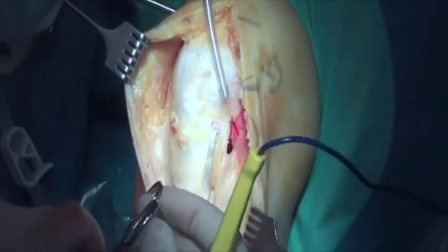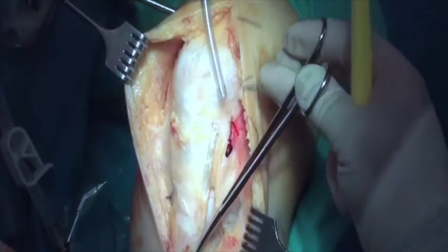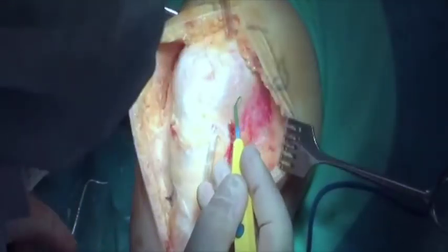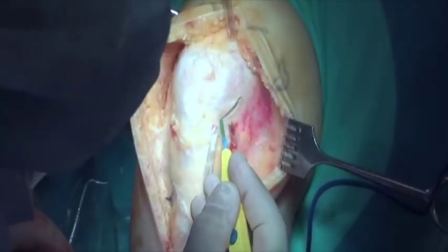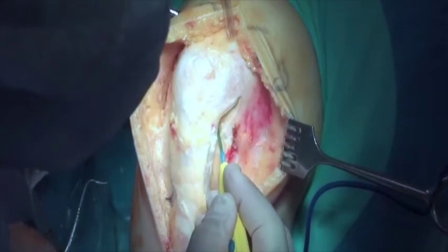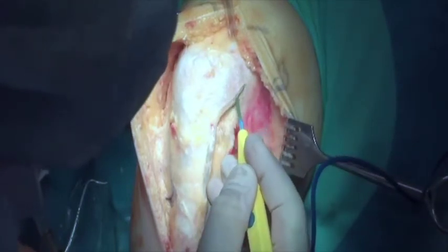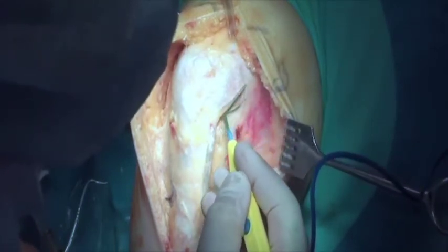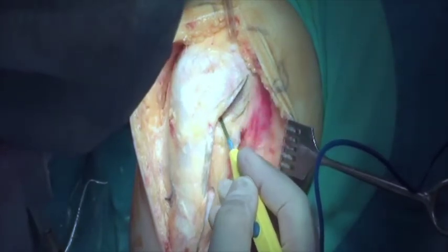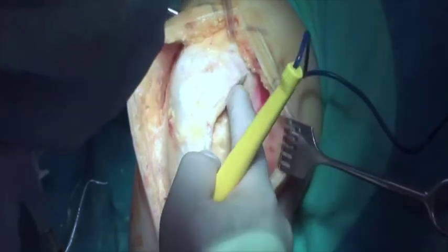A fasciotomy is then performed, releasing the proximal portion of the anterior tibial fascia. The lateral retinaculum is then carefully opened at the inferolateral tip of the patella, and the lateral release is carried far enough proximally to allow the patella to center.